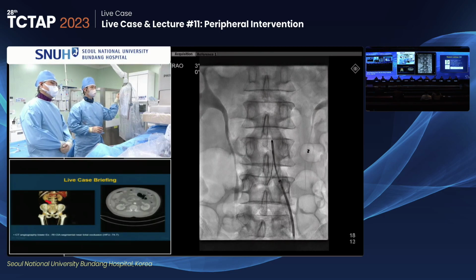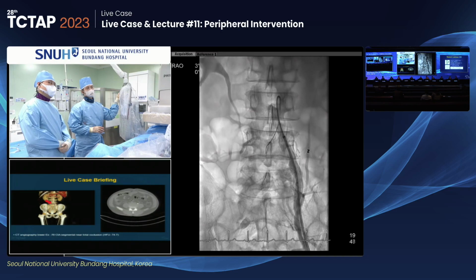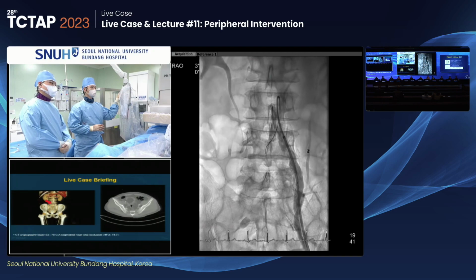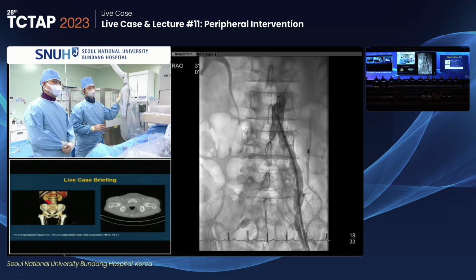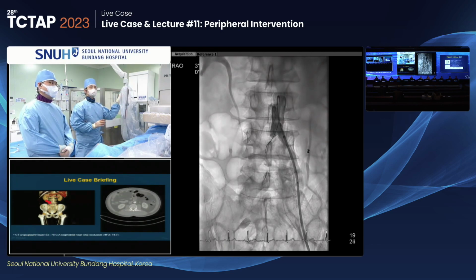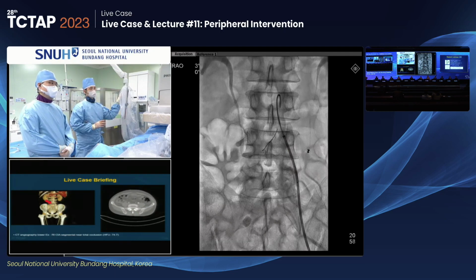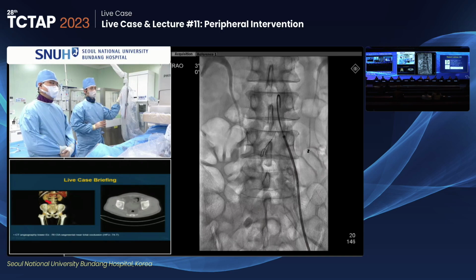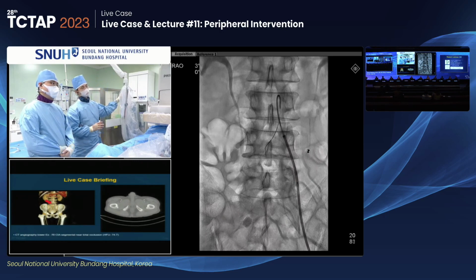I advance the CXI catheter, and I can check the progress with this contralateral angiography. You can find the CXI and wire are penetrating into the lesion, but it doesn't go further. It's a very tough lesion. It is not a thrombotic lesion, so this was stuck in the middle. And then I push the wire and make a small loop and advance. The loop technique guarantees the wire is inside the vessel.